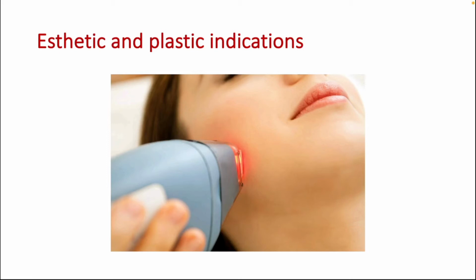One of the most common procedures performed with laser is cosmetic skin resurfacing, by removing the surface layer of the epidermis and the superficial papillary dermis, contracting the dermal collagen and allowing the skin to re-epithelialize in a more uniform manner. The advantage of laser surgery in aesthetic and plastic surgery is based on hemostasis, decreased scarring, and decreased post-operative disability. That's it for my part.